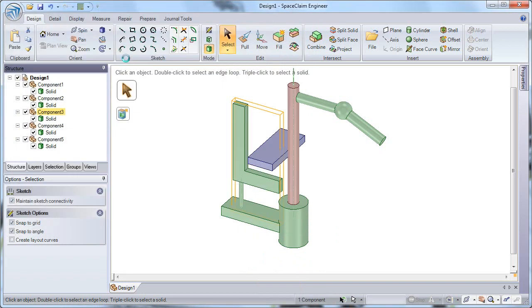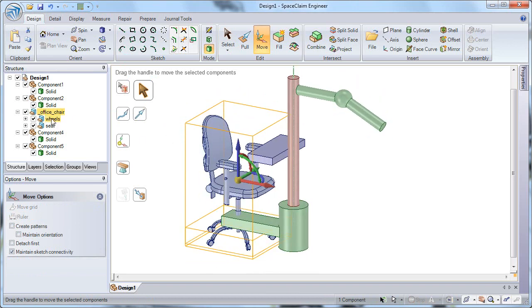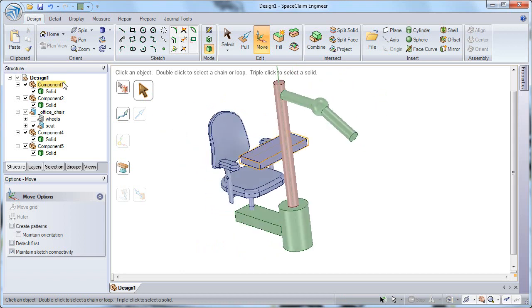And so SolidWorks data can be imported just as easily as SpaceClaim data and edited using the same exact tools that you're used to using in SpaceClaim. So that office chair is going to come in with the exact assembly arrangement that was created in SolidWorks. So I've got the chair assembly and the wheel assembly subassemblies. And I can toggle that wheel subassembly off to choose not to display it in my model.